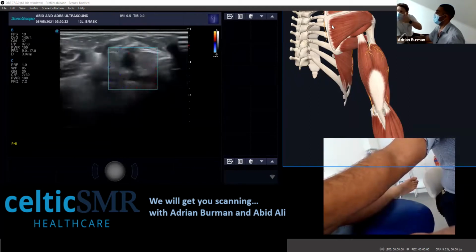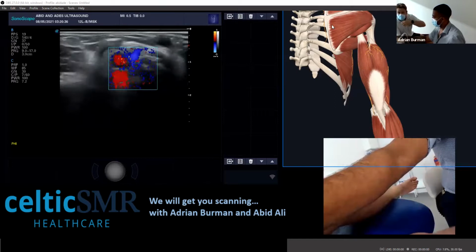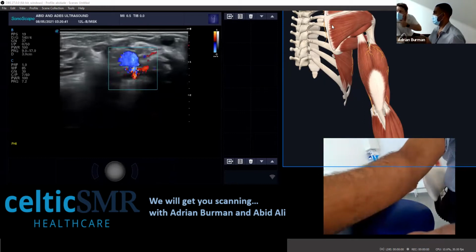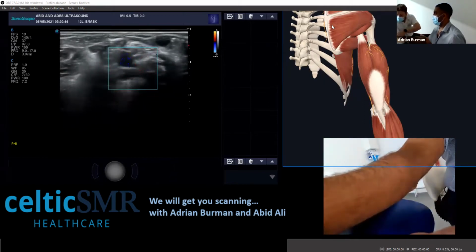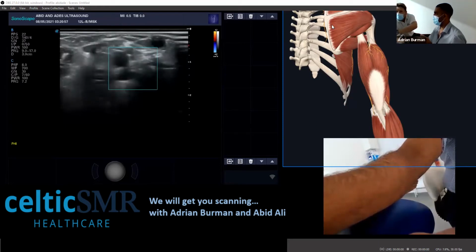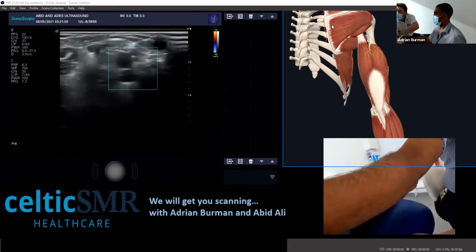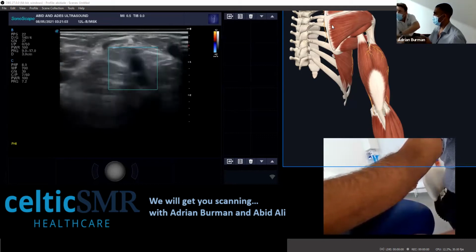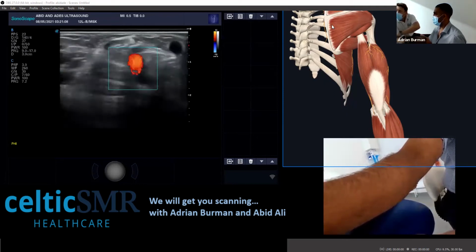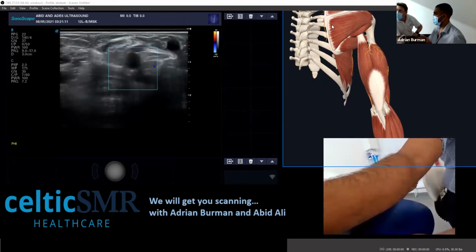So the slightest movement is just going to give you an overpowered colour flow sensitivity because it's looking for low flow and it's obviously quite a fast flow. So you take the scale up to say I want to look for faster flow, and then it meets the requirement. So now I'm up too high, 42 centimeters a second, and it's not reading it because it's too high. So this is what I mean by say it's crucial to get your settings right. So come down the scale, and then you'll start to pick up the flow again nicely.